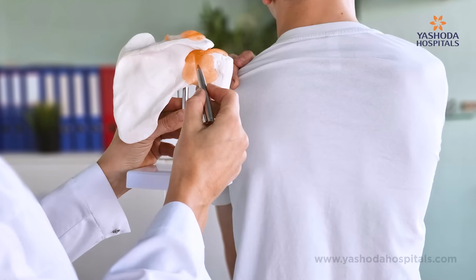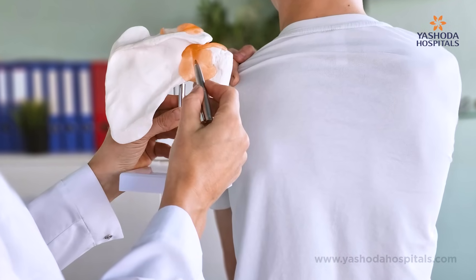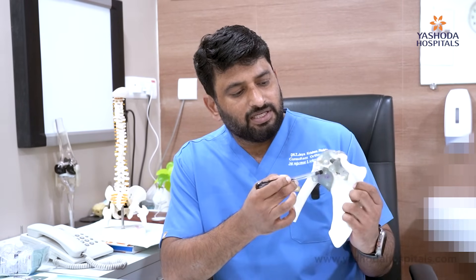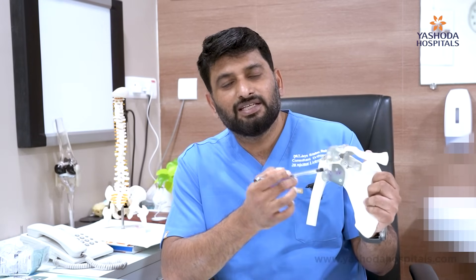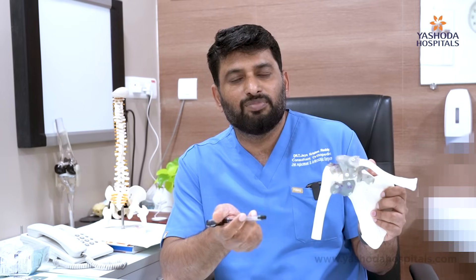Reverse shoulder arthroplasty is a type of shoulder replacement surgery where the socket and ball of the shoulder joint is reversed. As you can see on this bone model, the ball is on the arm side whereas the socket is on the chest bone side. In reverse shoulder arthroplasty, we fix the ball on the opposite side and the socket on the arm bone side, by which the patient can regain normal movements.